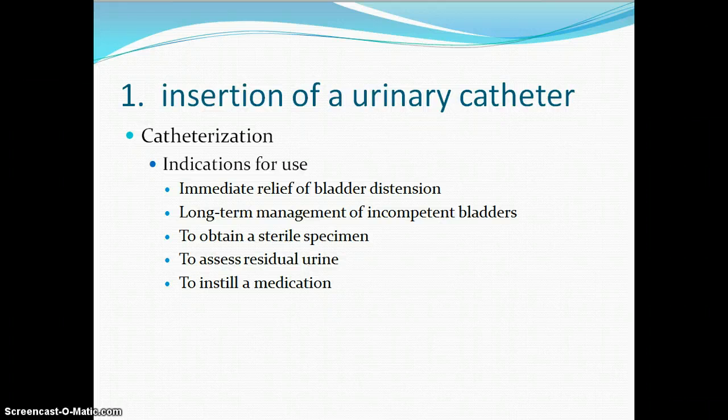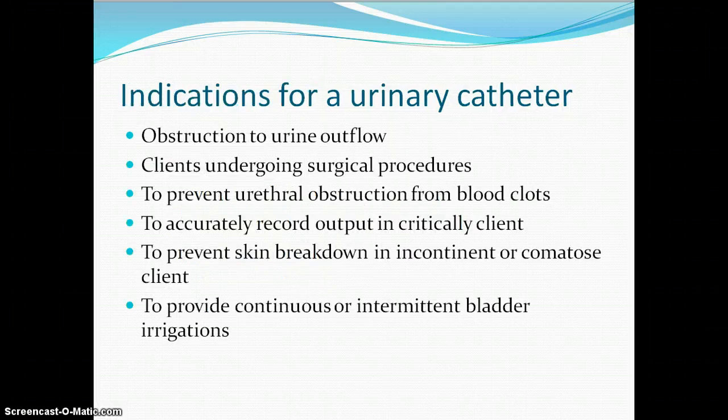We catheterize for many reasons. One is not for our convenience because we don't have time or don't want to get a patient up to the bathroom. The skill is talked about on page 1071, and we will be practicing that in the intro lab.